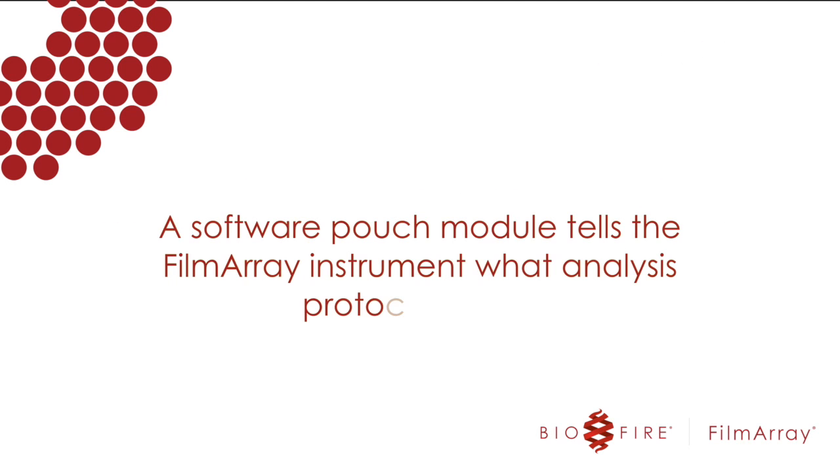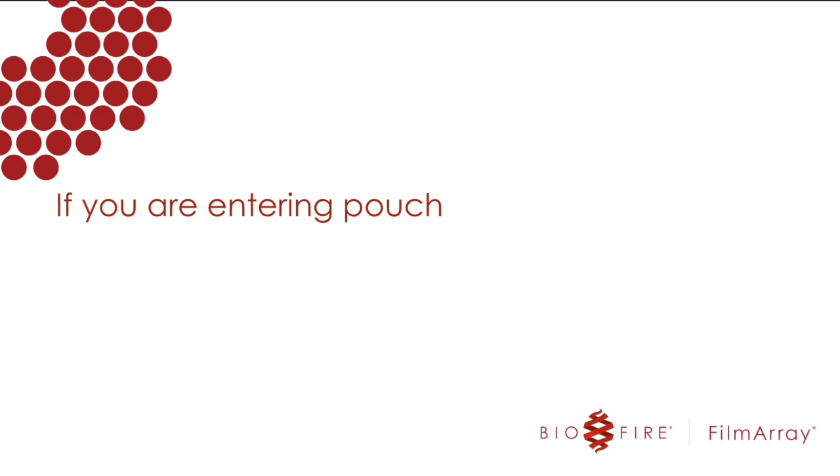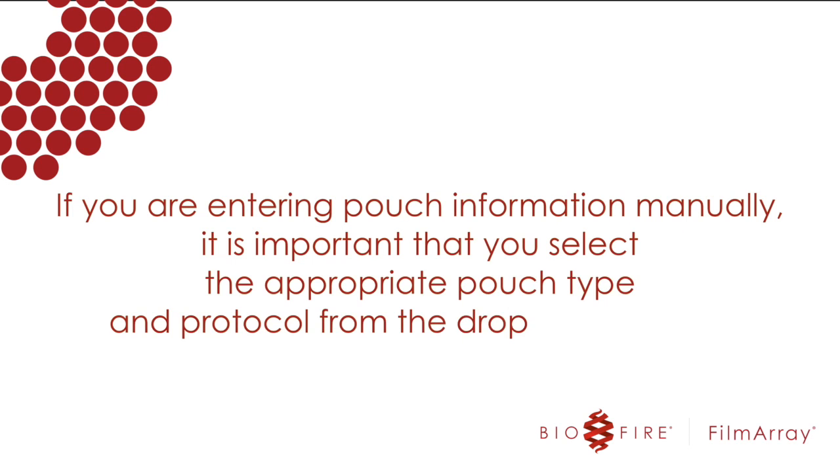A software pouch module tells the FilmArray instrument what analysis protocol to run based on what type of pouch you are using. When you scan the pouch barcode, the appropriate pouch module is selected. If you are entering pouch information manually, it is important that you select the appropriate pouch type and protocol from the drop-down menu.